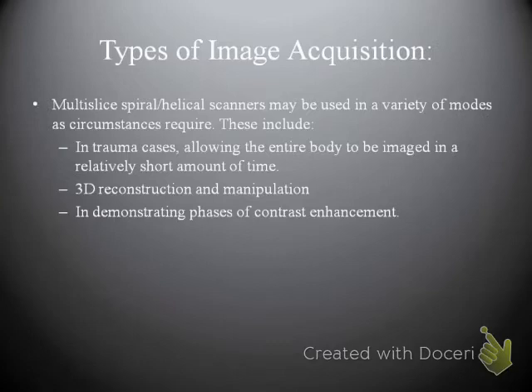If the attending physician is really concerned that something may be going on, they can actually come over to the CT suite while you're reconning and look at images that are being processed, or they can wait a few minutes for everything to be transmitted to PACS. But multi-slice CT really shines in trauma situations. And that's really because we can use 3D reconstruction and manipulation. So if there's something that you want to see just a little differently, we can pretty much recon the images however you see fit.